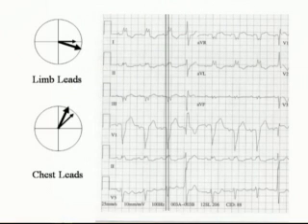So here, if I go to V1, I cut my QRS in half, the last half of this QRS is well below the 0 line. That tells me the left ventricle is the guy who didn't get the signal to be activated. Now, once I see that it's the left ventricle, I'm going to ask the question, is it the conduction system disease that has caused this problem, or is it intrinsic to myocytes? Are they just not communicating well?